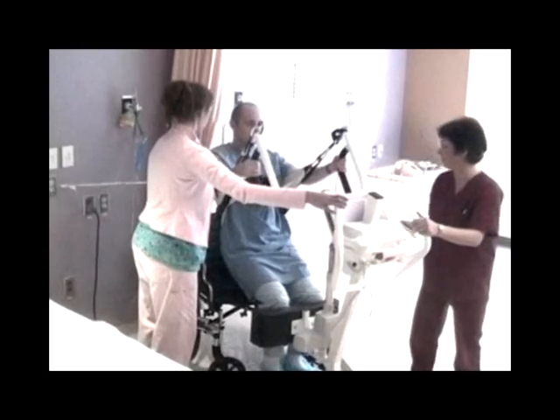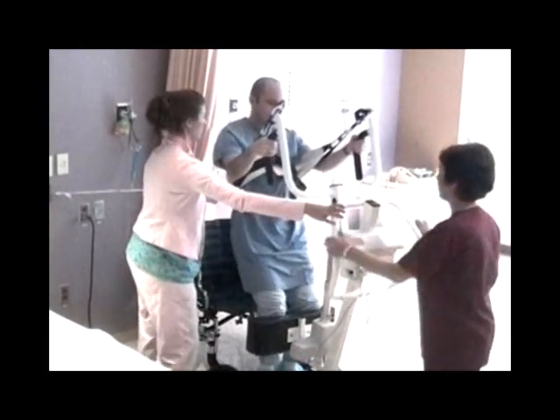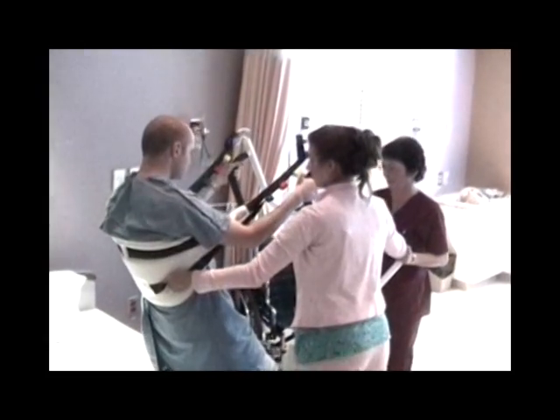Tell the patient to continue to hold on to the lift handles. Lower the patient onto the bed or the chair. Guide them into a sitting position.